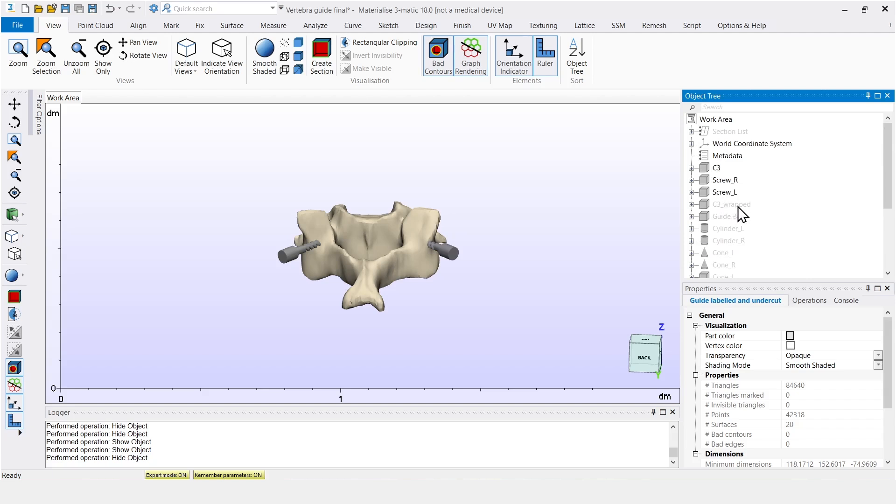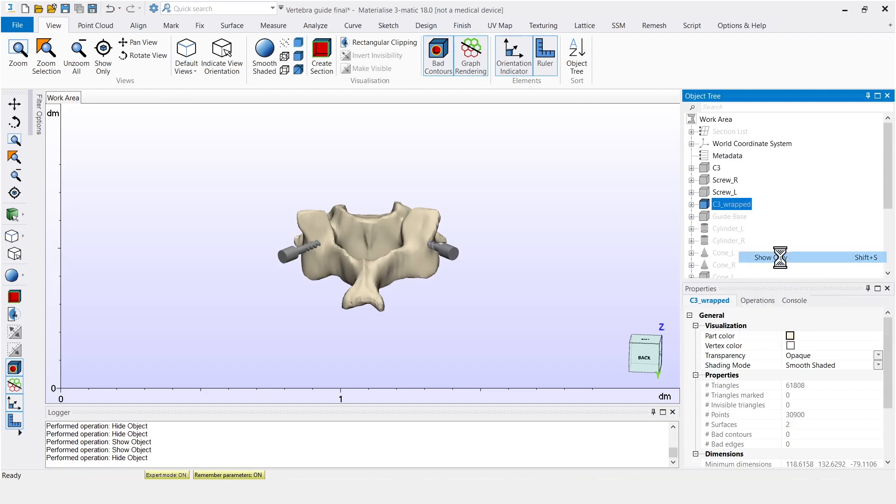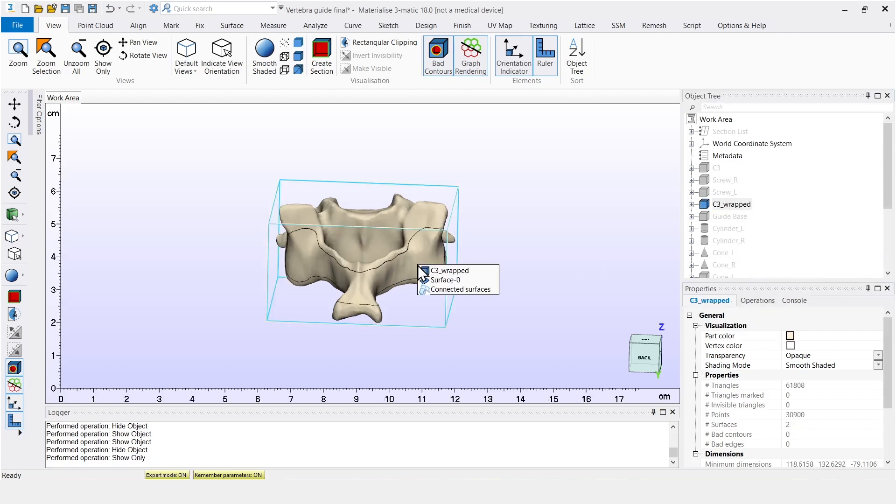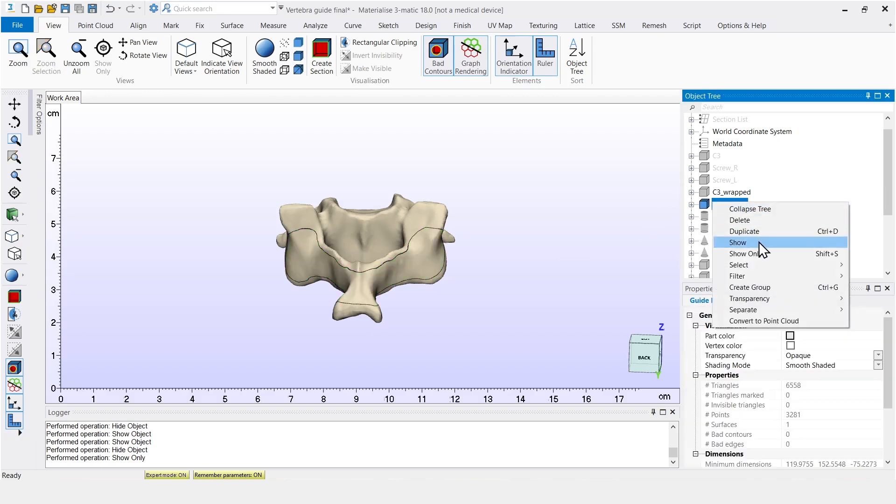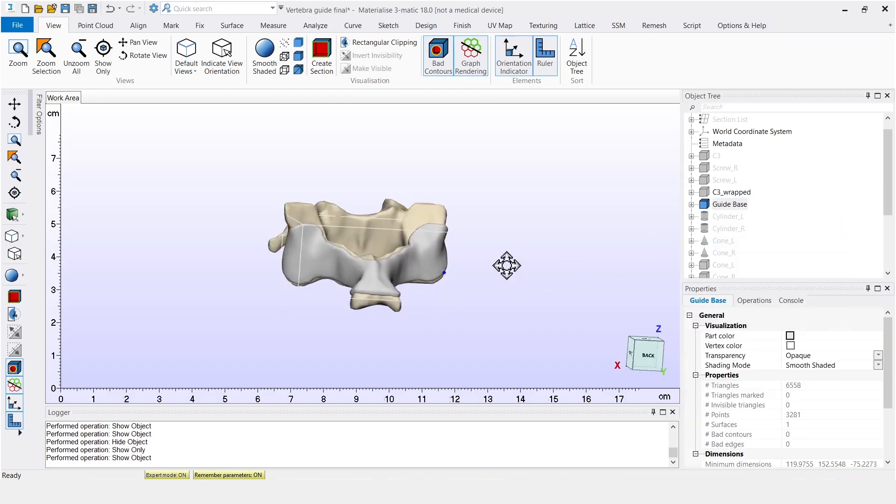First, we indicate an area on the vertebra that is going to act as our base. And then we can give it a certain thickness. In this case, it's one millimeter.